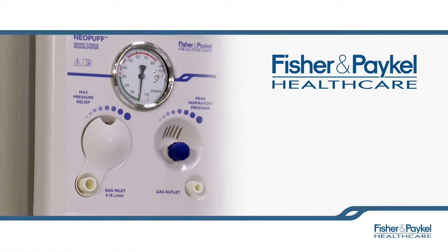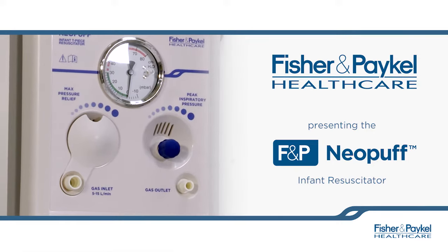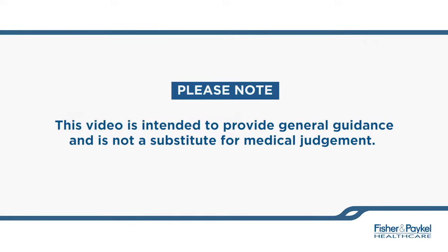Welcome to this short training video on the Fisher & PayCal Neopuff Infant Resuscitator. Please note that this video is intended to provide general guidance and is not a substitute for medical judgment.